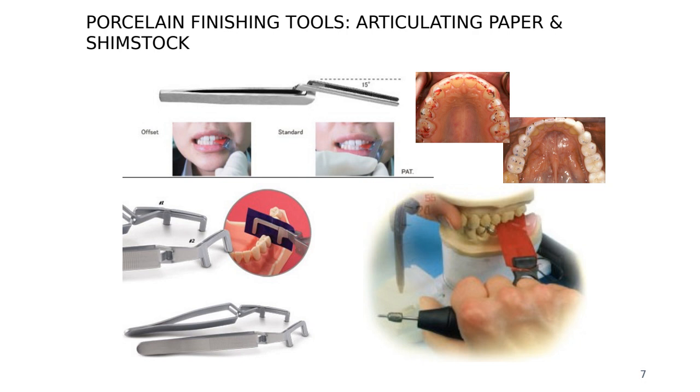Basically, it'll be difficult for any lateral movement if you only account for the vertical. So what are some of the consequences? It might come off. It'll break. Break what? The crown, it would break the porcelain. What else?